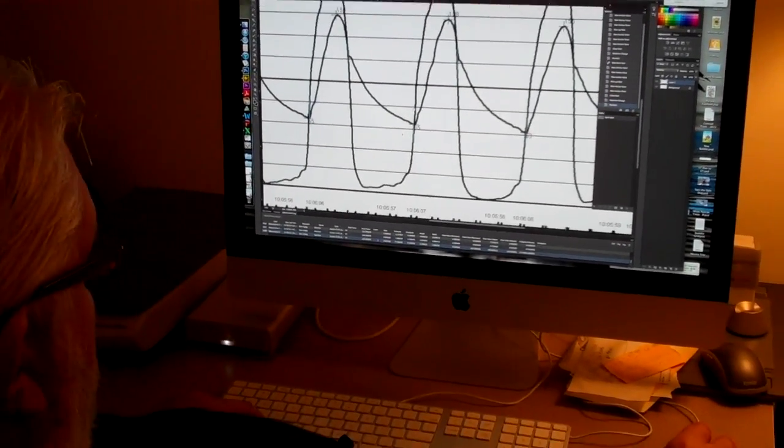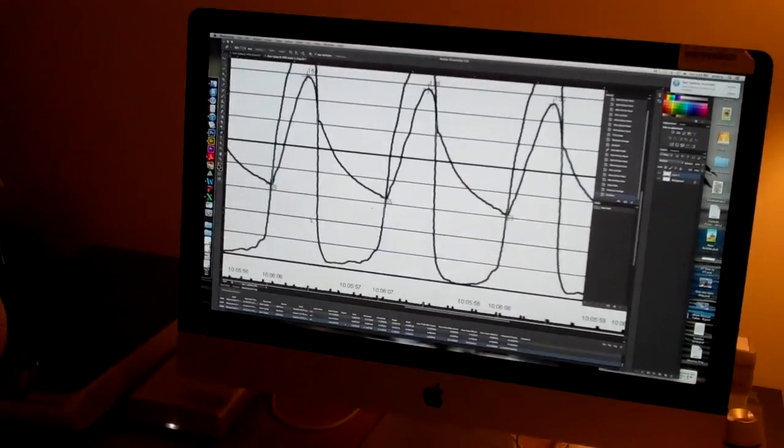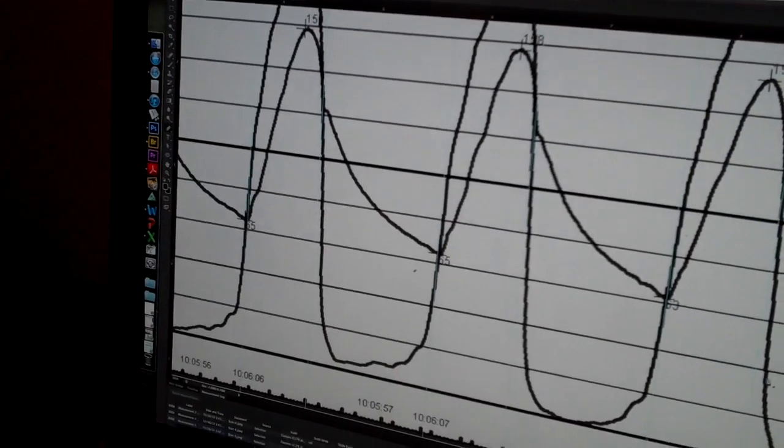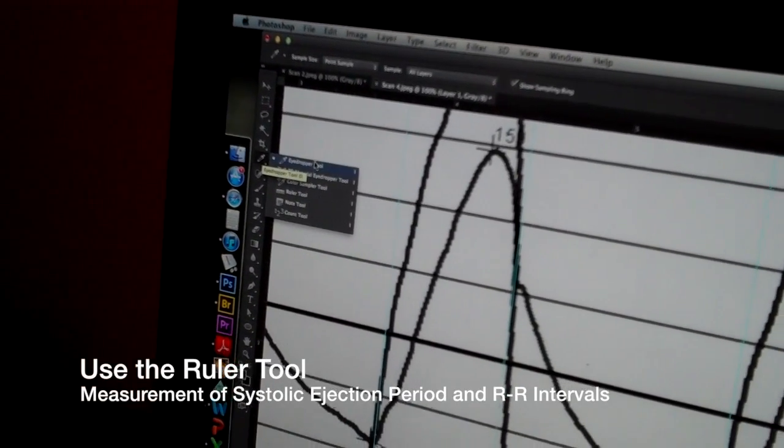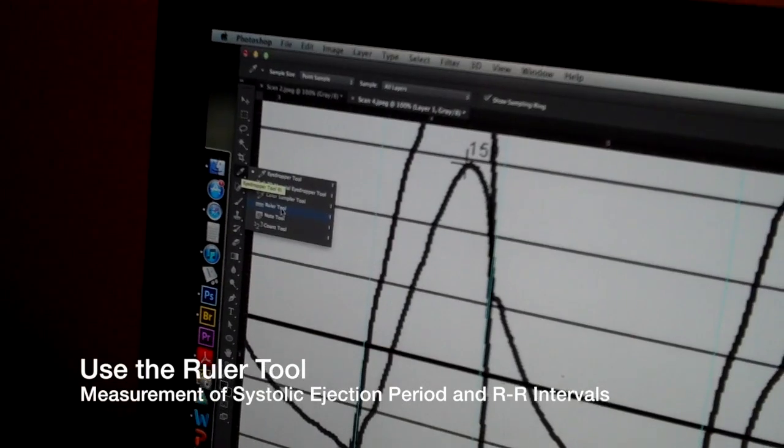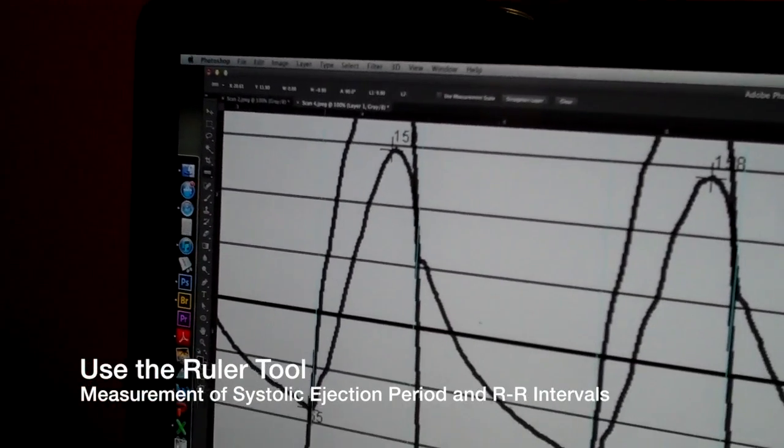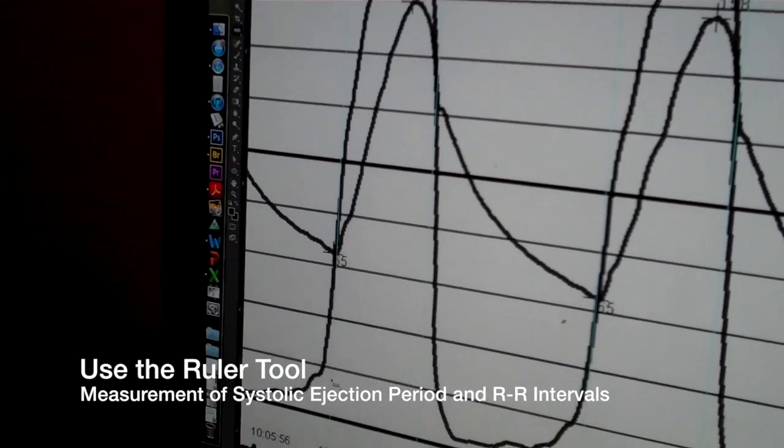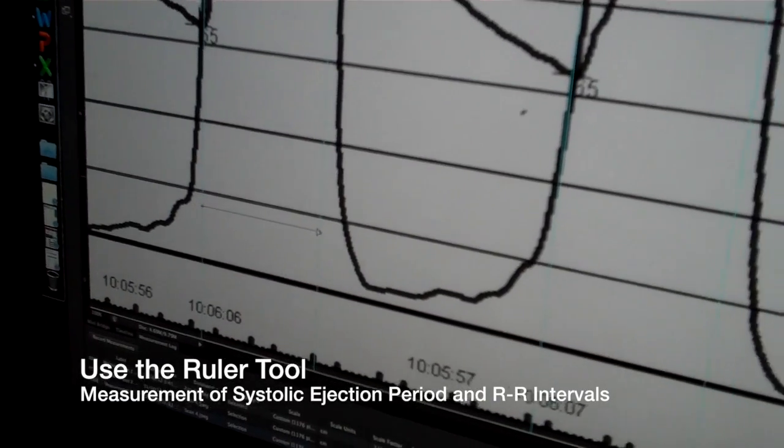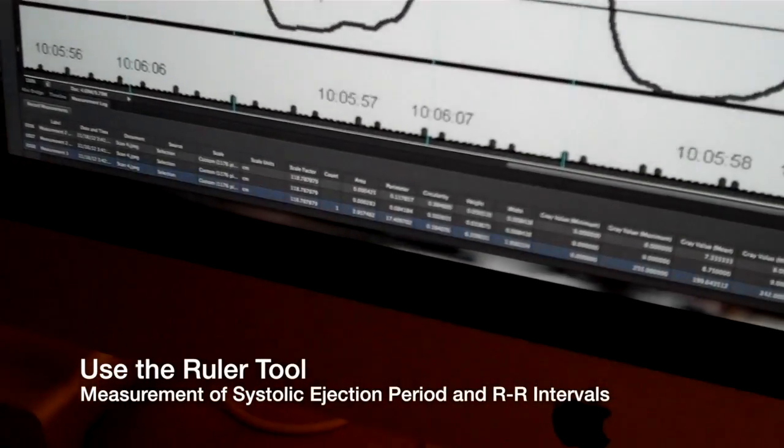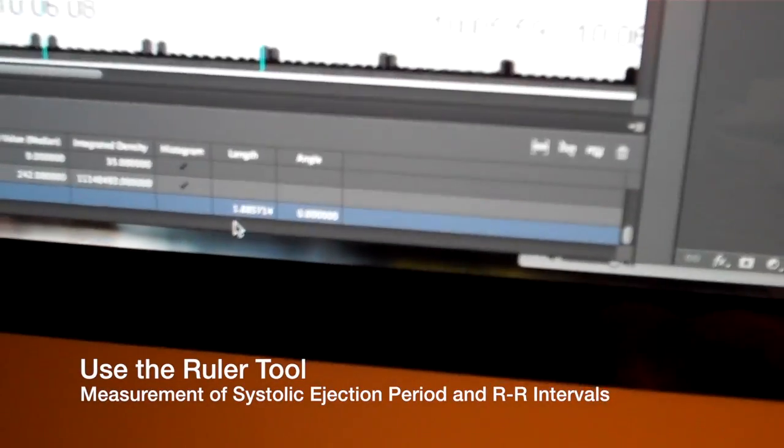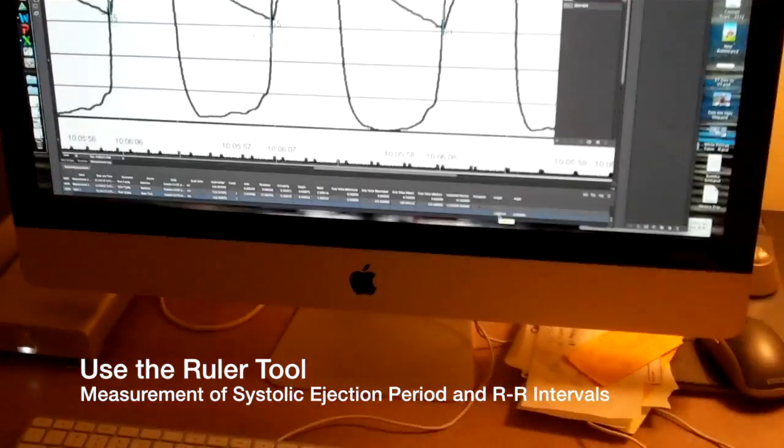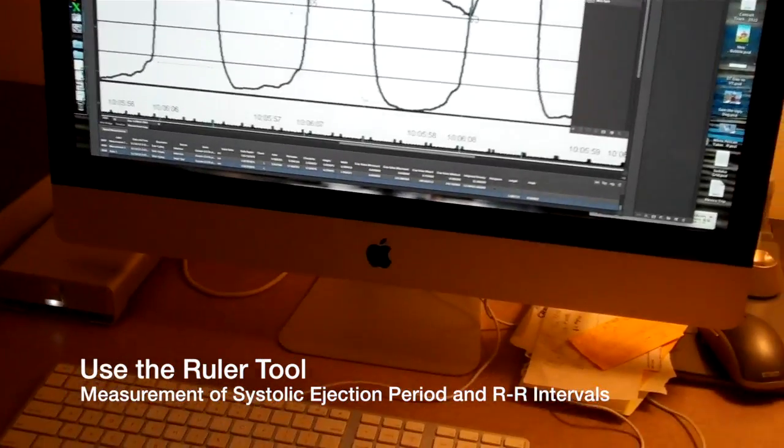I already know that the other thing I need is that I need these three lengths. I need the lengths of the systoles in centimeters. So I'll go up here to the eyedropper tool, and as part of the eyedropper tool is the ruler tool. And I'll select the ruler tool. And I'll go between these guides, hold the shift key down which constrains this to a straight line. And so command shift M again. And they put the length way over here on the right. 1.88 or 1.9 centimeters is the first length of the systole.